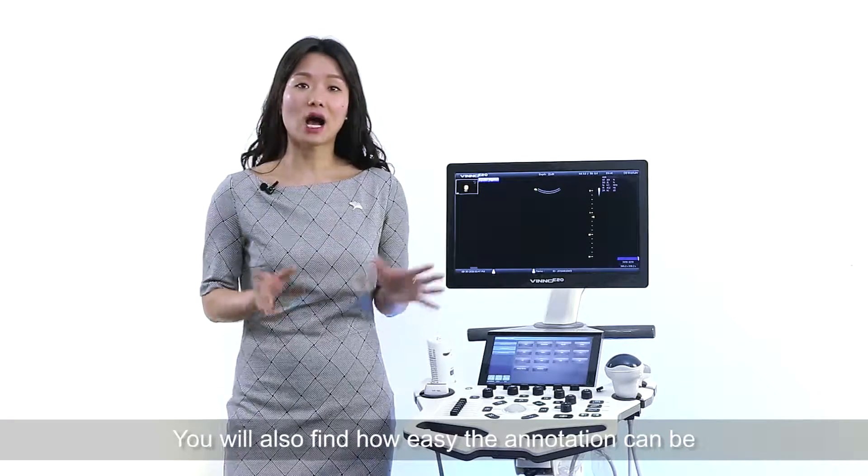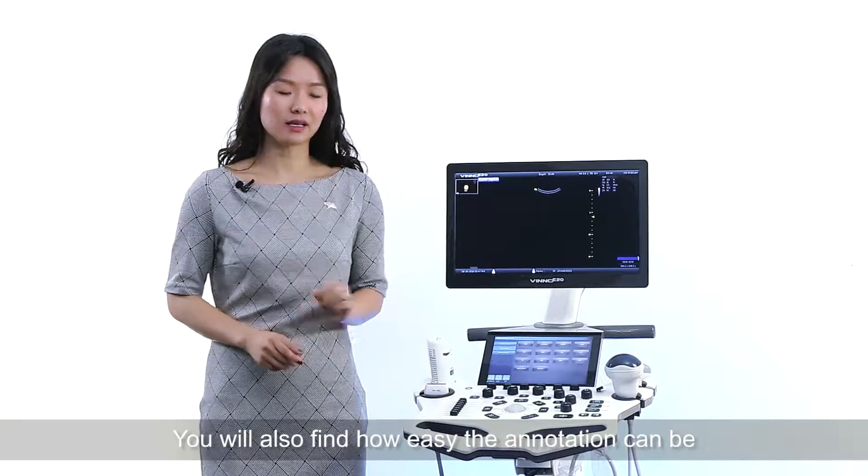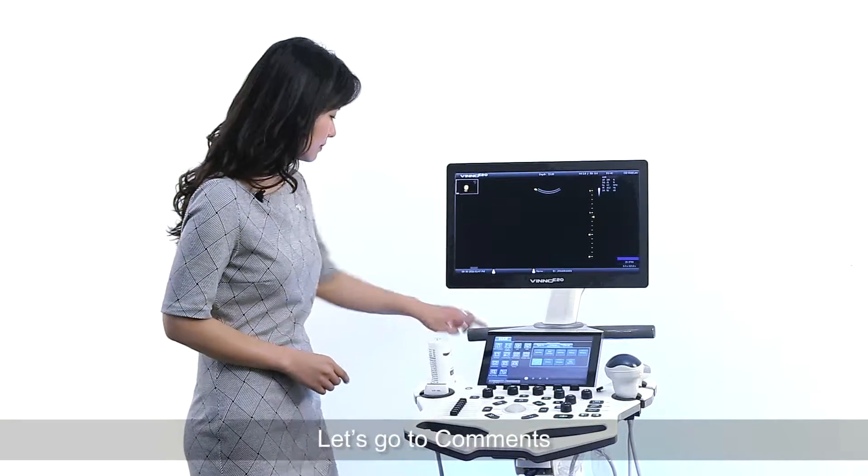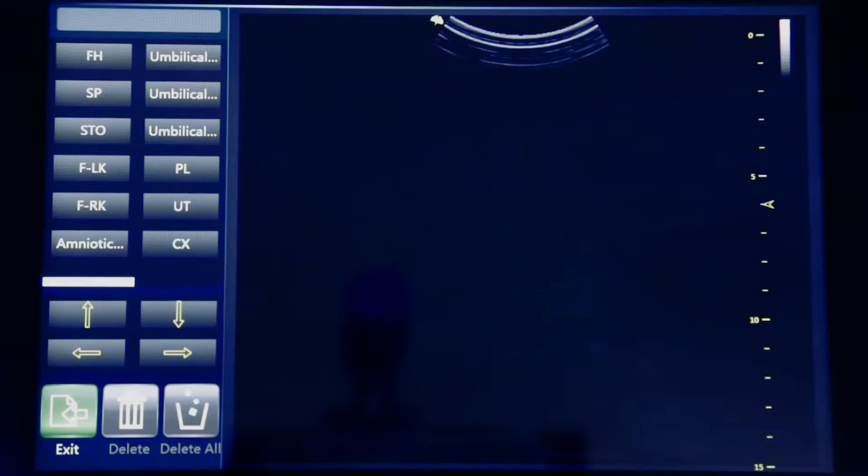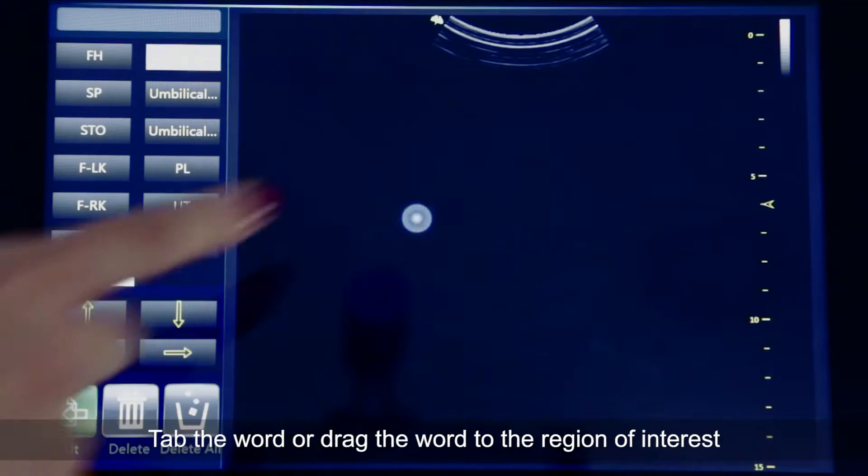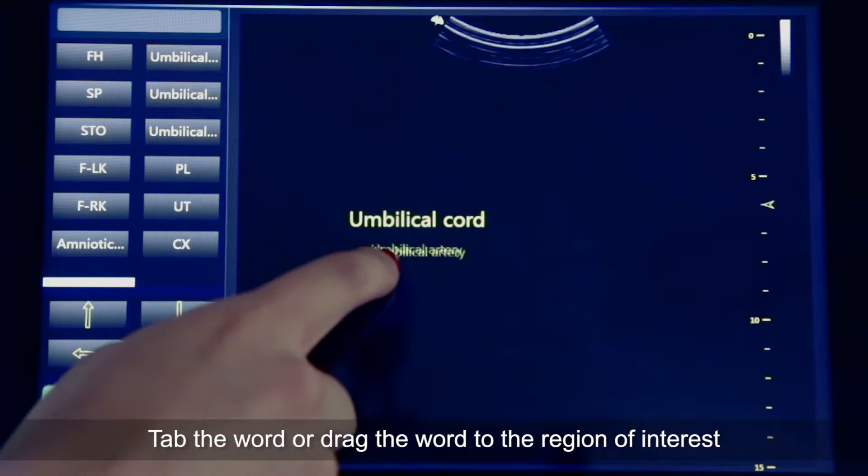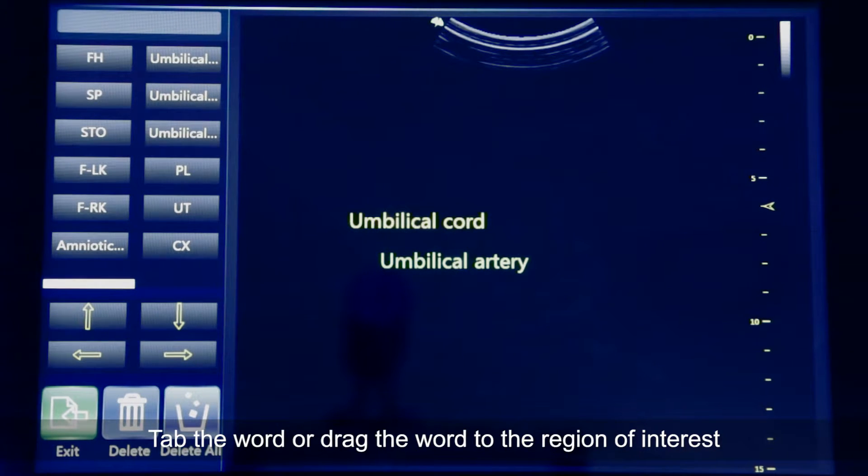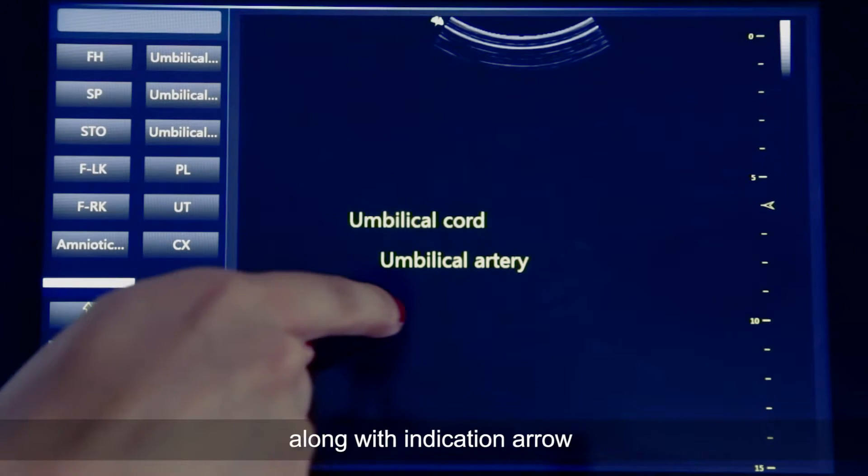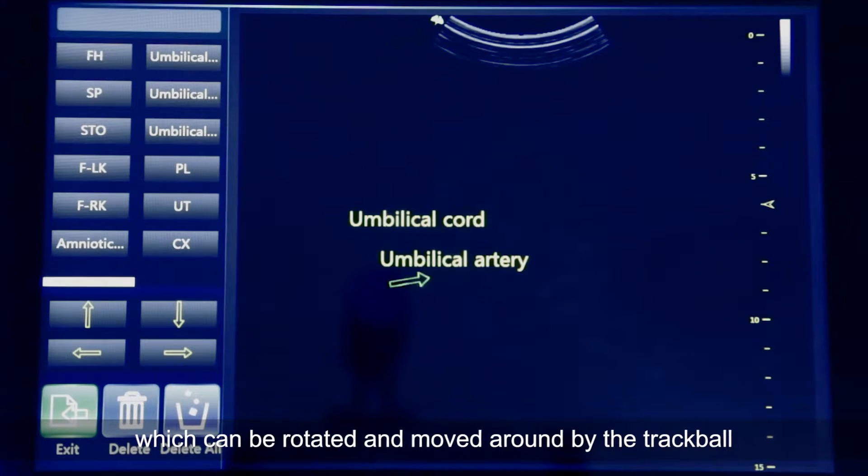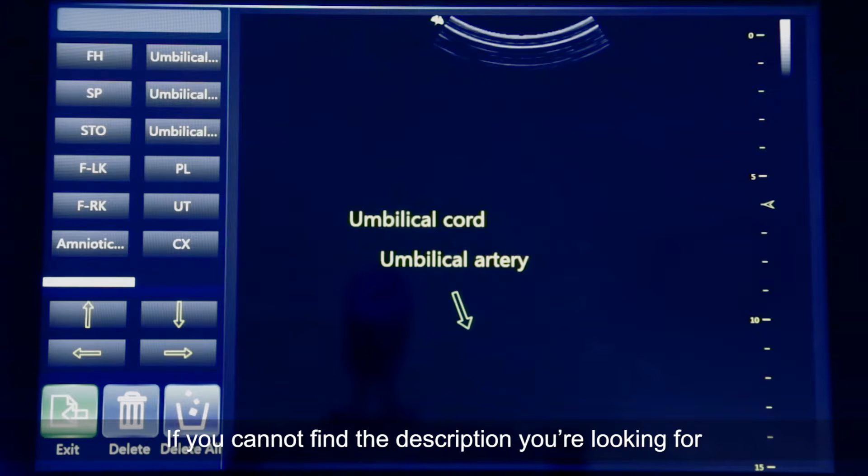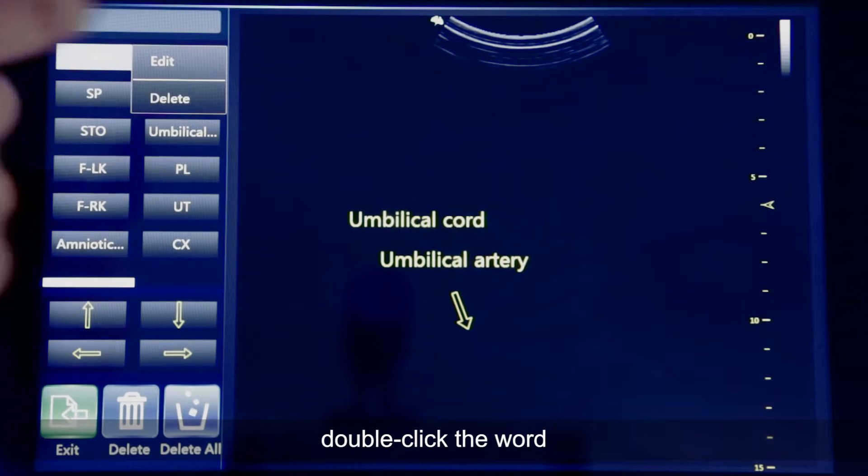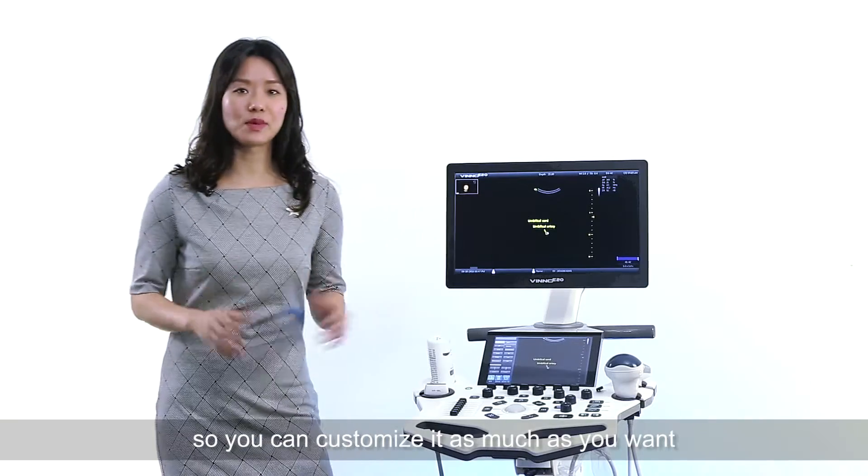You'll also find how easy the annotation can be. Let's go to the comments. Tap the word or drag the word to the region of interest along with the indication arrow which can be rotated and moved around by the trackball. If you cannot find the description you're looking for, double-click the word so you can customize it as much as you want.